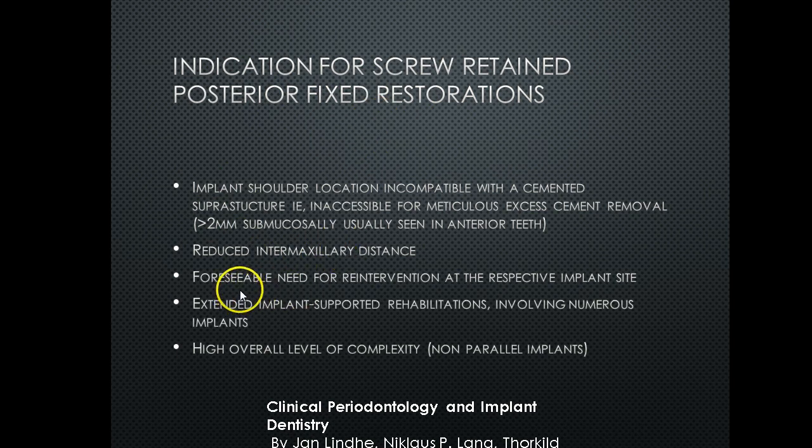If there's a reason that you're expecting things to be retrieved at a later time or changed, it's nice to have a screw-retained restoration, because unlike cement, where you need some kind of solvent to dissolve the cement out, in screw-retained it's much easier because you just go through the opening and unscrew it, take it out, and put it back on. So that's one of the nice advantages.